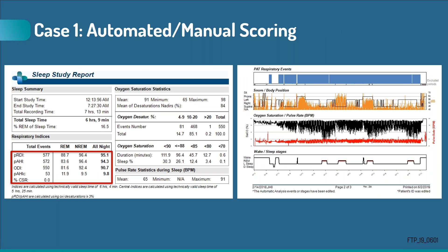We've got abundant evidence that this is not only a patient who has severe apnea — 15 episodes in a 10-minute stretch becomes an AHI of roughly 90 episodes per hour — but we've also answered that we see all the features of obstructive and not central apneic episodes in the profile of the oximetry, the abrupt resumption of snoring at the arousal, and the reflection of respiratory activity in the actigraph. We can confirm these features with an AHI of 90 episodes per hour, an ODI also of 90, and very low percentage of central compared to obstructive episodes. This is a patient with severe obstructive apnea, no clear evidence of alveolar hypoventilation during sleep, all the features of obstruction with worsening of apnea in REM, and snoring throughout the night.